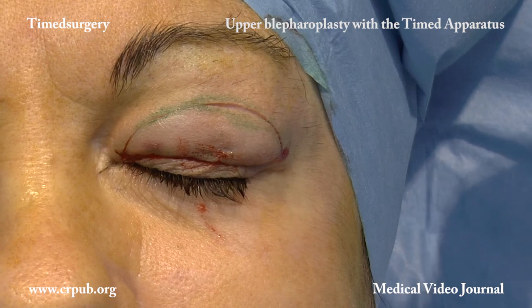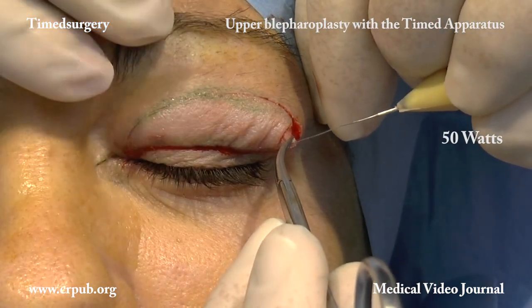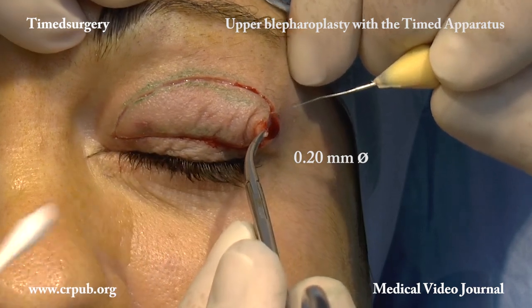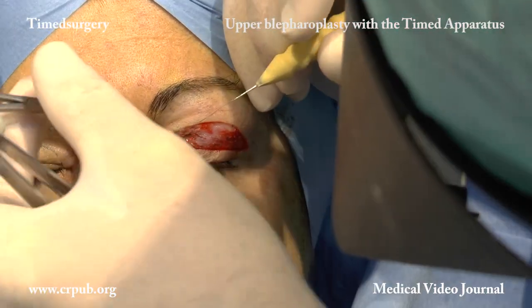Once the skin incisions have been made in the two eyelids, the power is increased to 50 watts and the EM10 white electromaniple is replaced by a 0.2 mm diameter EM10 yellow electromaniple.